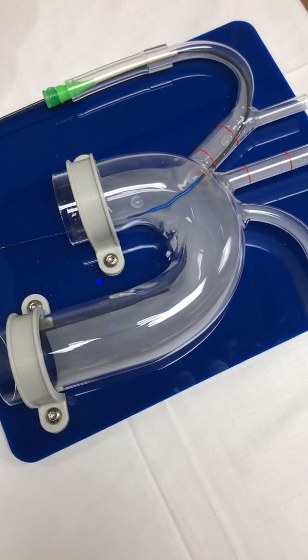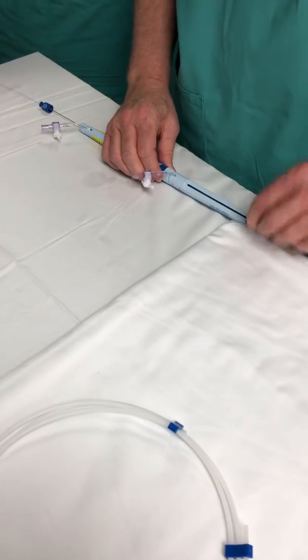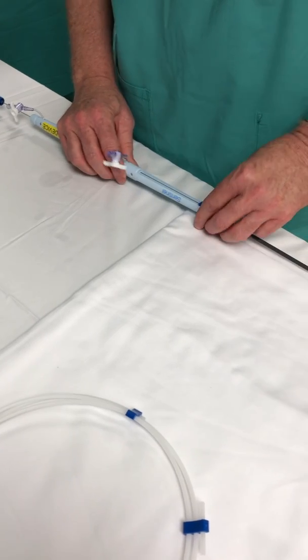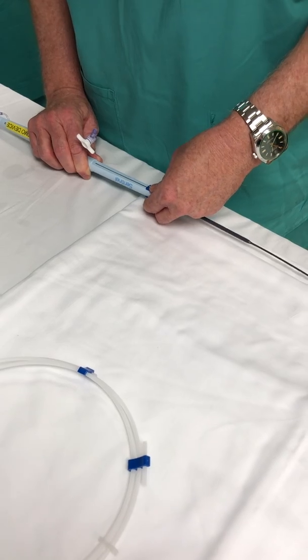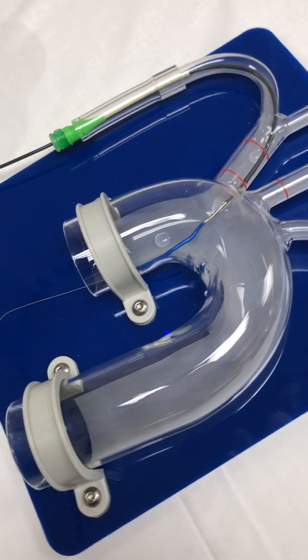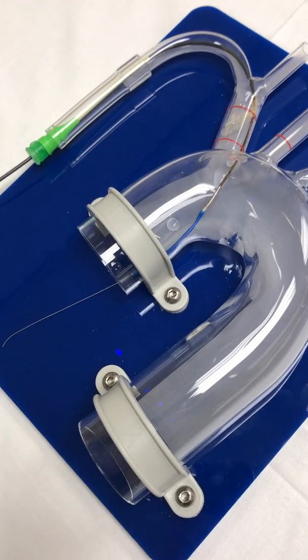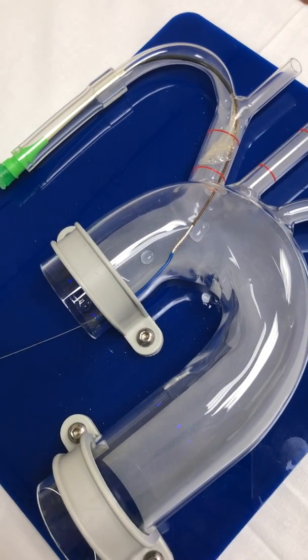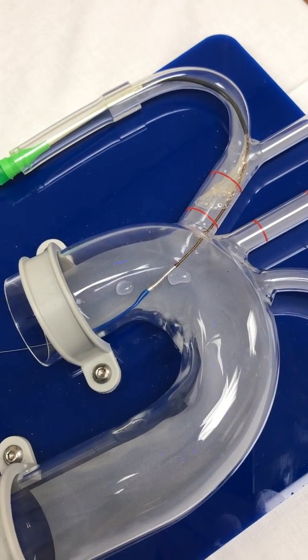Now we're going to go to number three, then to number one, and deploy that proximal filter. We'll start sliding this back — you can adjust your placement as you're deploying this device. The goal is one to two centimeters above that ostium. And now we've deployed number one.